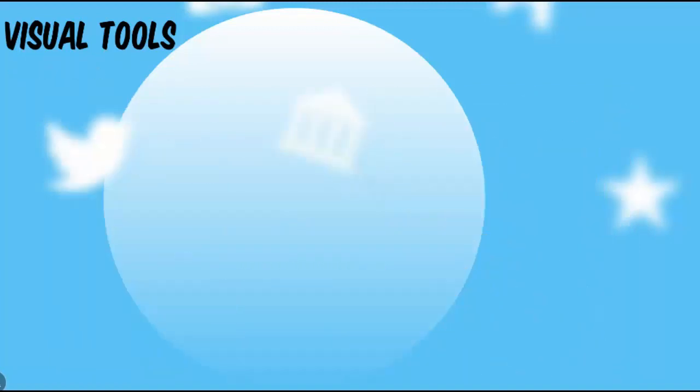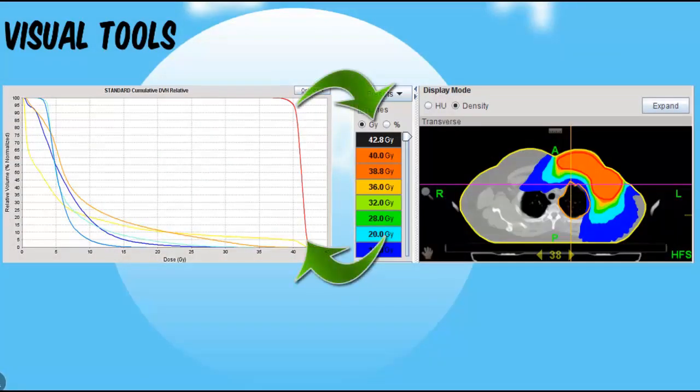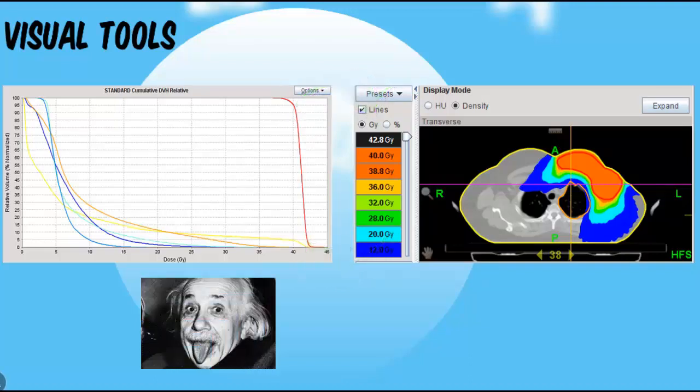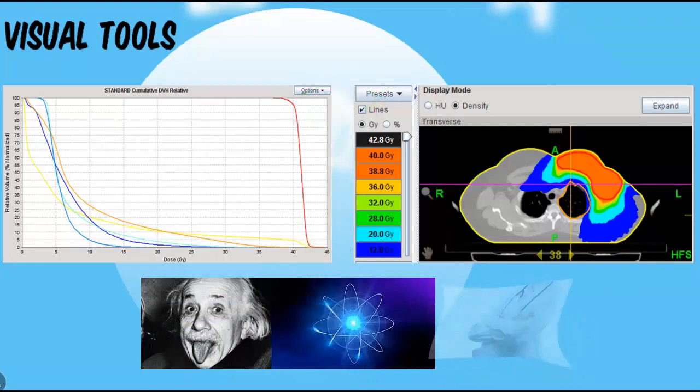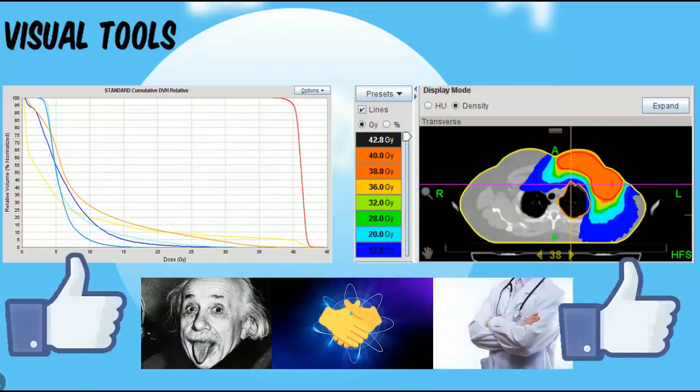It is very clear how analytical tools and visual tools complement each other to have a better analysis of the treatment plans. It's important that the physicist, dosimetrist, and radio-oncologists check these treatment plans together because every patient and every treatment plan is completely unique.